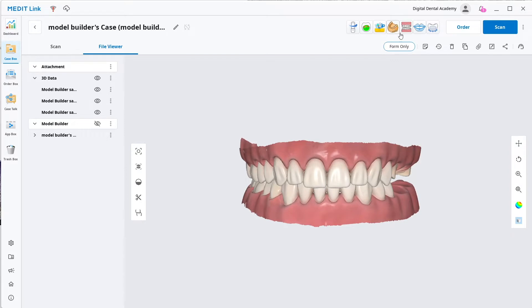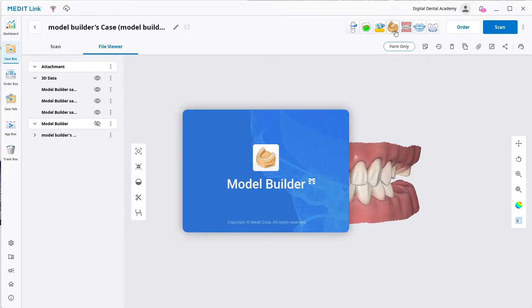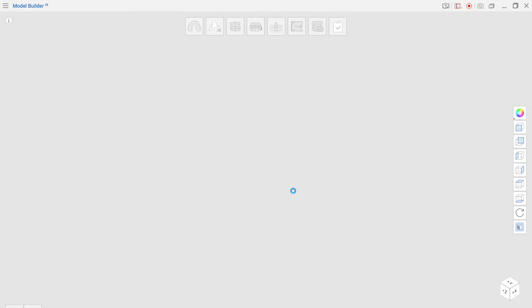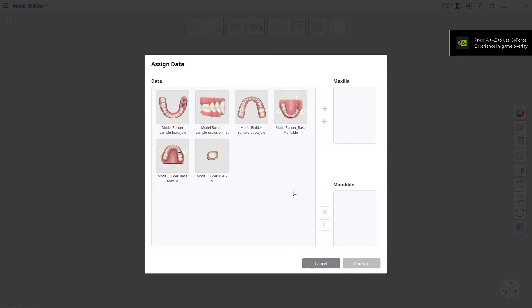We're going to take it straight into this icon here, the Medic Model Builder. You can see there's a whole range of different apps, the Model Builder is one of the most popular and it's an excellent app. I've already done this before so I'm going to click cancel because we're going to do a new project.